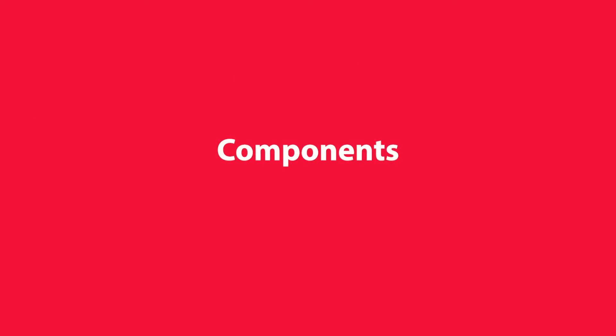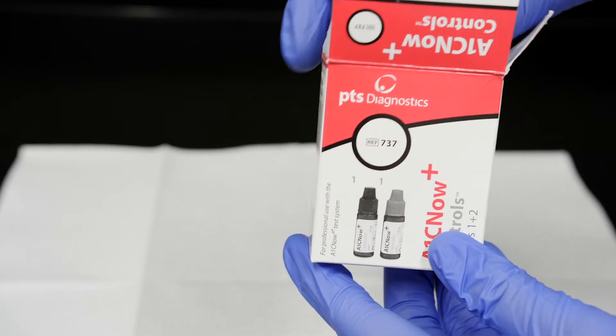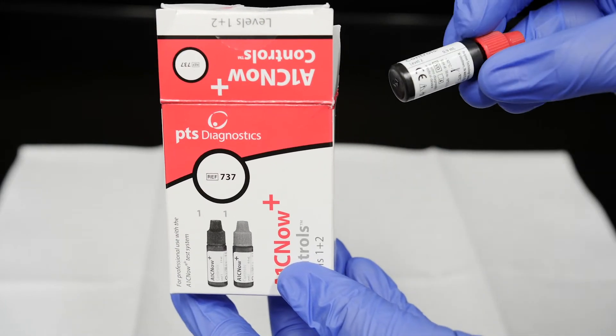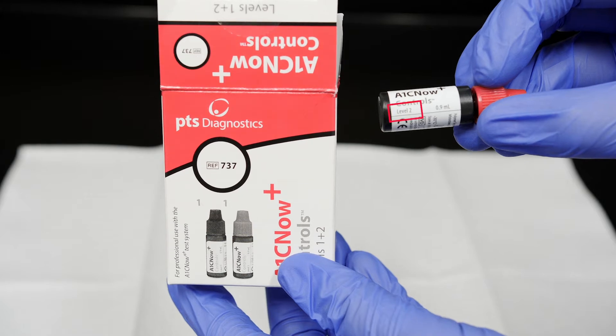Components. A1C Now Plus Controls contain ready-to-use blood-based Level 1 and Level 2 controls in 0.9-milliliter dropper-style vials and instructions for use.